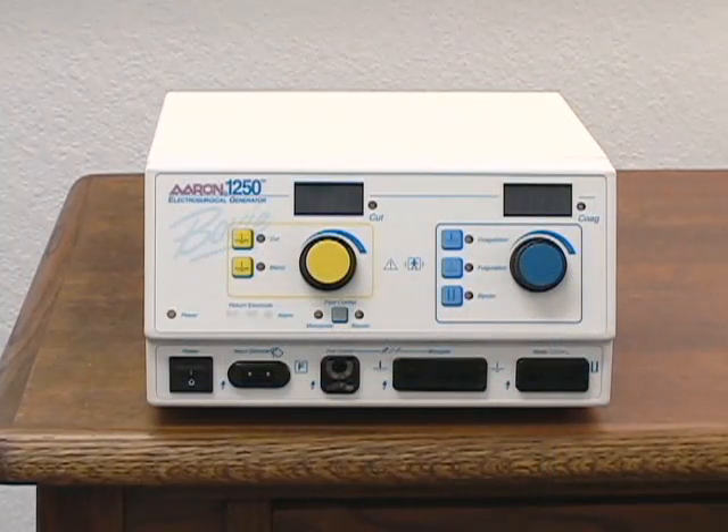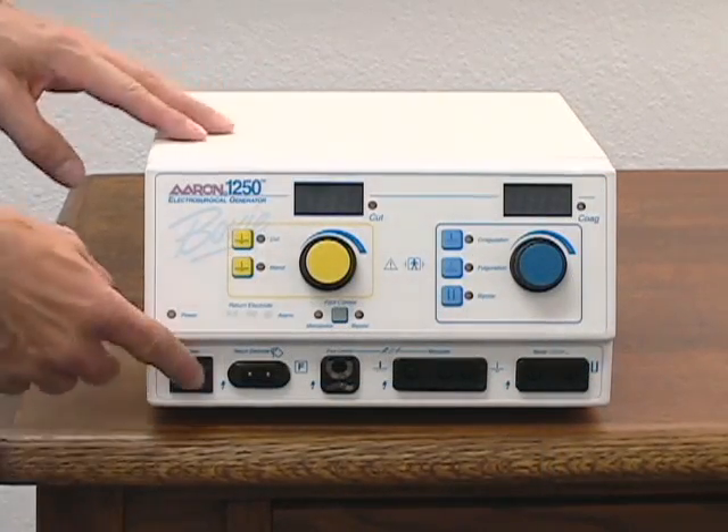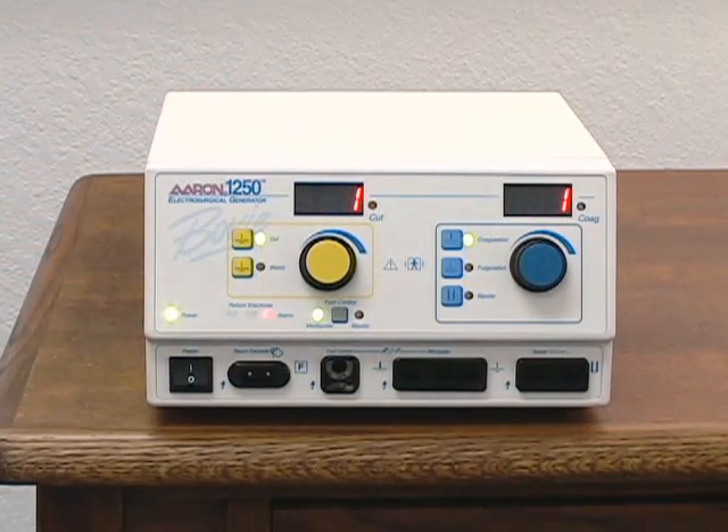To power on the ARIN 1250, flip the power switch to the on position. It will perform a self-test to verify its operational status.